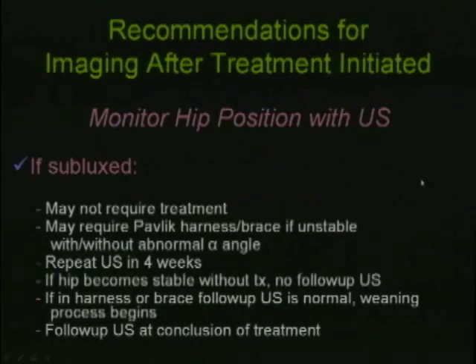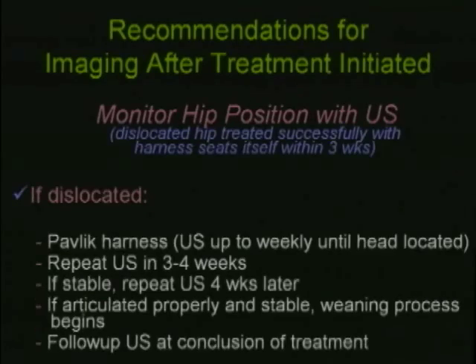So just a little word before I come to the end of this presentation about the monitoring of the hip position with ultrasound. If the hip is subluxed, we may not be in the situation where treatment is indicated. It may just be that we're going to follow the ultrasound exam that we did with a repeat exam in about 4 weeks. If the hip becomes stable without treatment, then we don't need to follow it with ultrasound. If it's in a harness or a brace and the follow-up ultrasound is normal, then weaning begins, and follow-up ultrasound at the conclusion of treatment is appropriate.